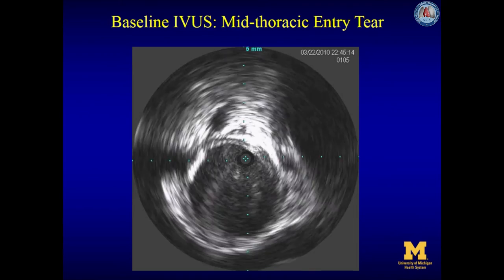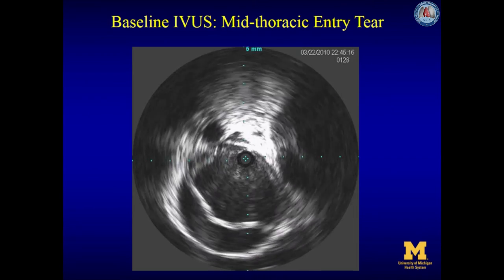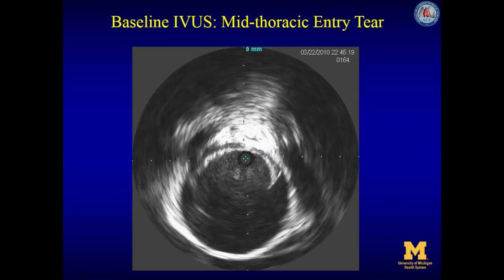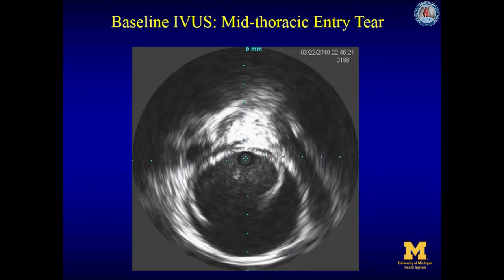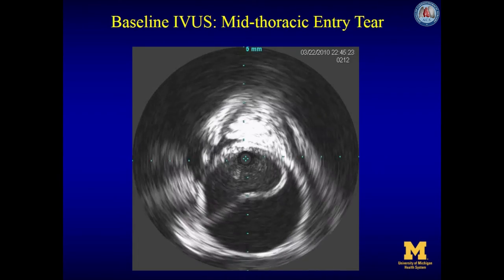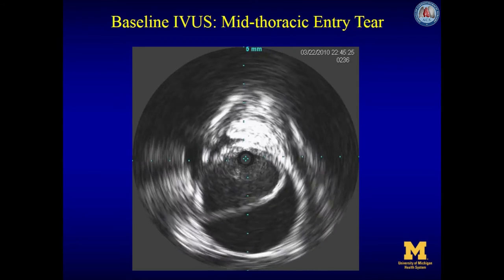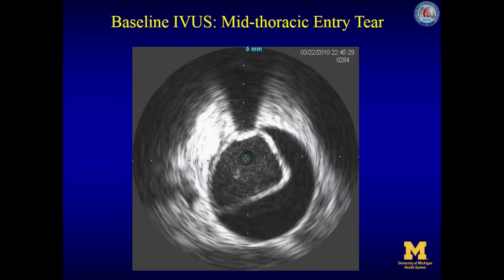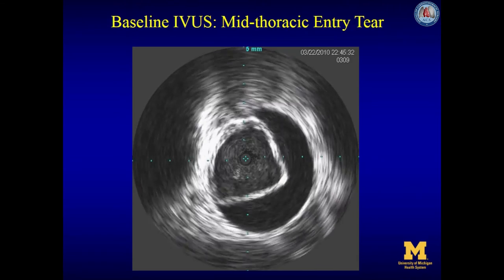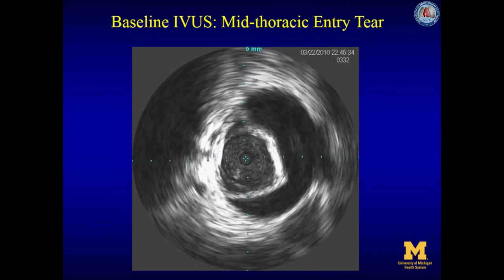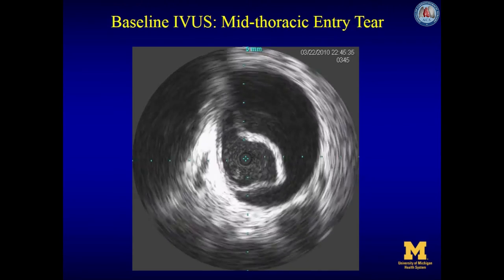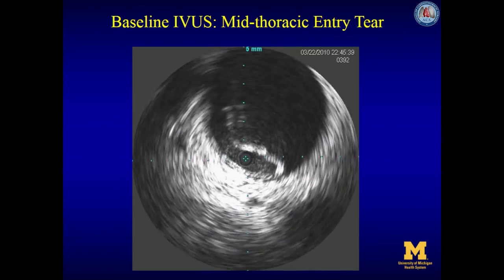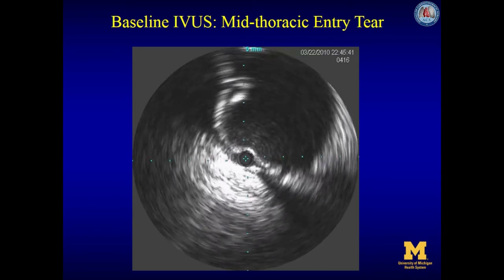This is an IVUS of the thoracic aorta above the dissection — we see just the beginning of the dissection between 5 and 9 o'clock, with the entry tear flapping. Now we are below the entry tear in the distal thoracic aorta approaching the diaphragm. At this point, the true lumen is becoming increasingly collapsed and is almost completely collapsed as we approach the visceral vessels.